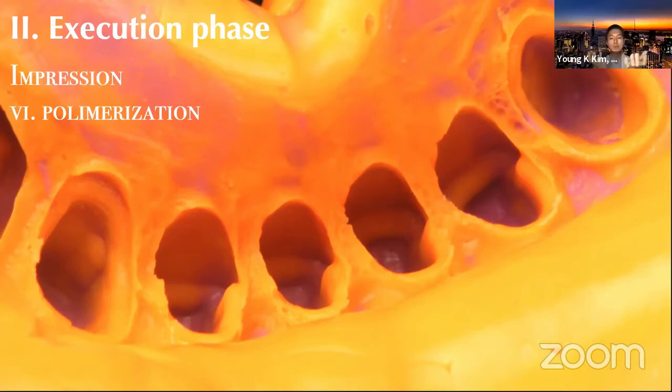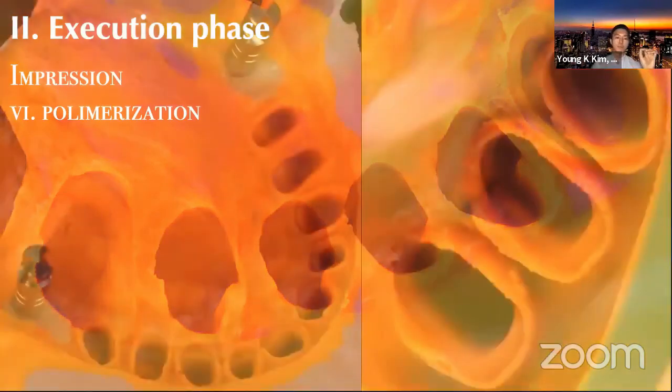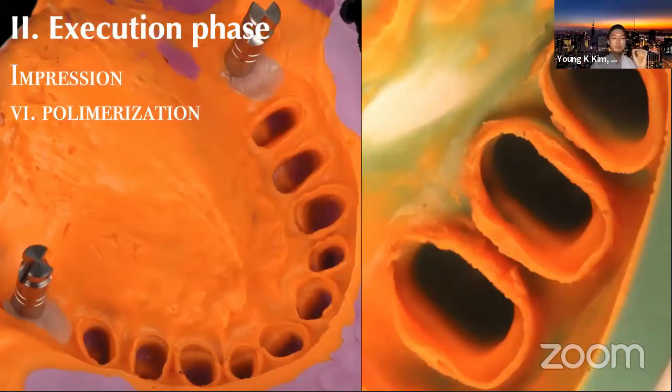So when you're holding the impression, let it set as if you're holding a baby, you know, you just hold it there. And then definitely your assistant would keep track with a stopwatch. After the initial polymerization, you seat the patient upright and keep holding, and the patient breathes through their nose, and you should inspect for no bubbles, irregularities on the margin. That's the absolute critical aspect.